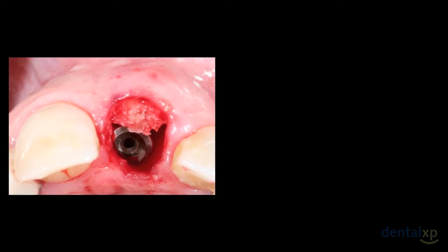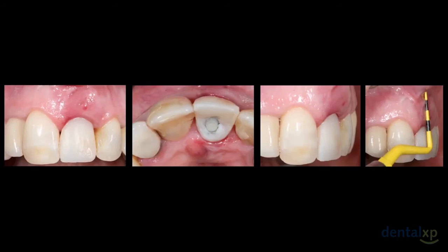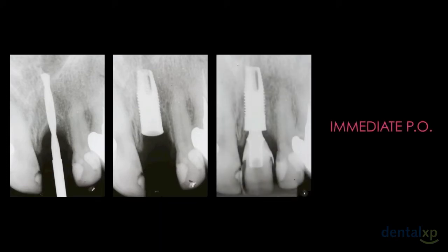After insertion of the corticomedullary graft and after completely filling the gaps with particulate bone, we can notice the volume of the graft at reconstruction and installation of the provisional crown. Pay attention to the correct three-dimensional position of the implant using a palatal anchorage. Here we have the immediate post-operative view before and after reconstruction, and we can observe the perfect filling of the spaces in the region that showed the bone defect.